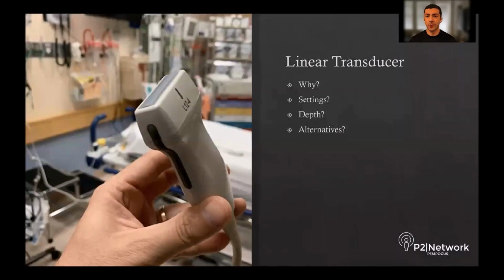We use the linear probe to scan skin and soft tissue lesions because the linear probe is a high frequency probe and that gives you a very sharp image. As you scan deeper structures, and pseudoaneurysm can be deep depending on the location, if you find yourself going deeper, you can use a curvilinear probe for evaluation of a pseudoaneurysm.